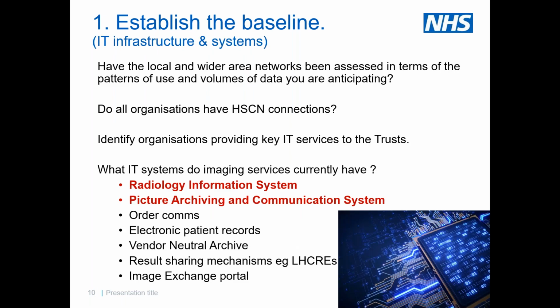And then that's a little bit further into the world of IT. What IT have you got? So do you all have HSCN connections? I'm hoping that the majority of you do. Well, I know the majority of you do. I'm hoping that everybody does. But there's something in checking that. Which organisations are providing key IT services to your trusts? So, for example, does one of your trusts have an outsourced IT support arrangement? If so, just worth understanding and realising, because they will have to be involved in those discussions as you go forward. What IT systems do you currently have?